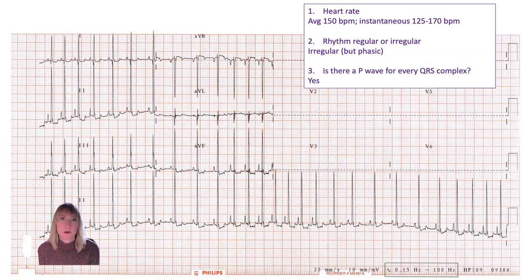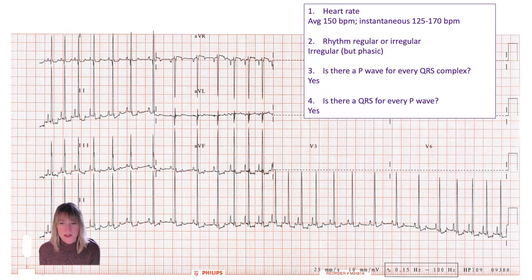Is there a P wave for every QRS? I do think there is. There is a small positive deflection in front of each of those QRS complexes. Similarly, there is a QRS for every P wave, so I don't have any lone or isolated P waves, nor do I have any lone or isolated QRS complexes.